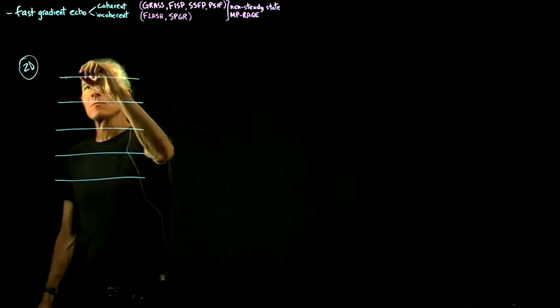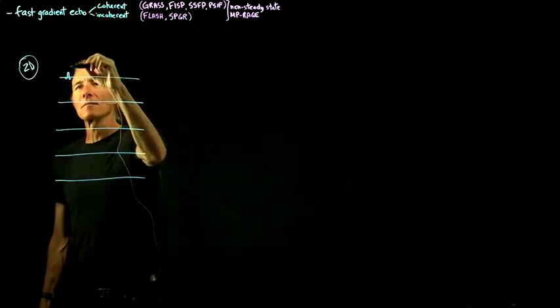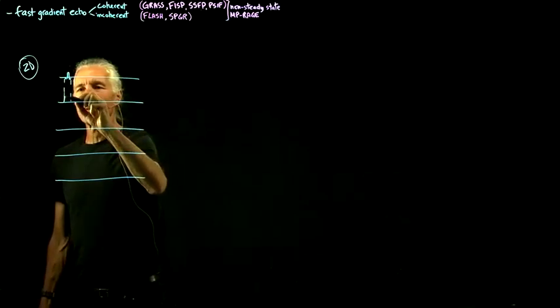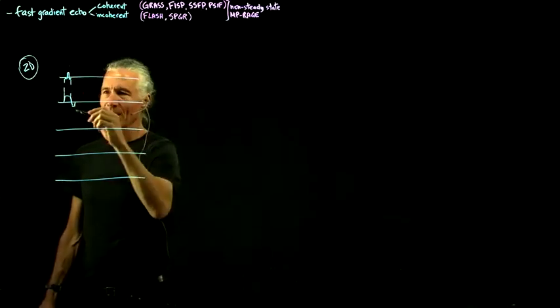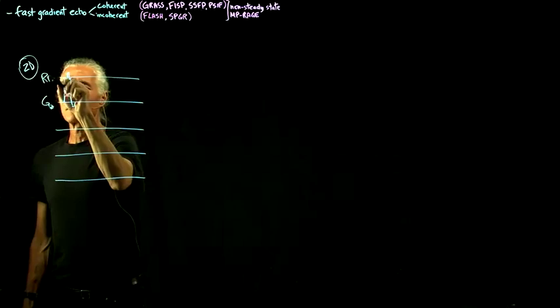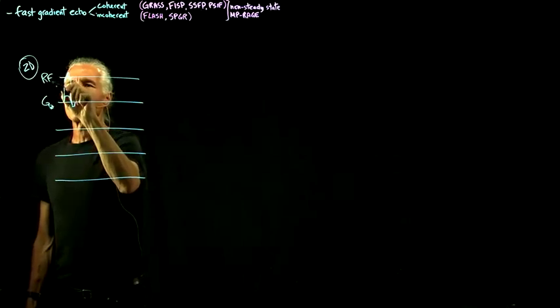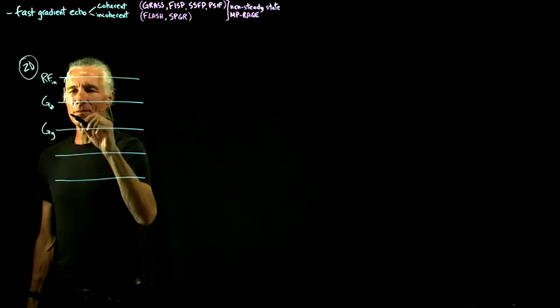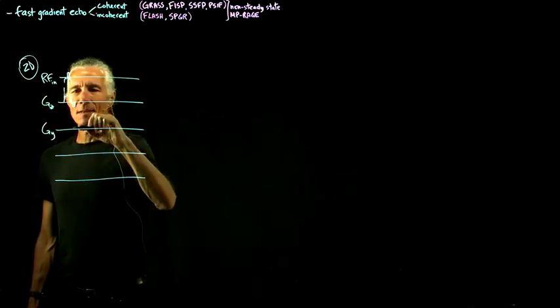So we do one pulse, say, we could do a 90, and then we pick out a slice and then fix the effect of having picked out the slice. So that's GZ, here's RF in, what we're sticking into the brain. Here's the phase encode direction.